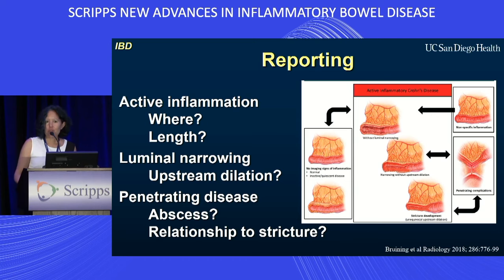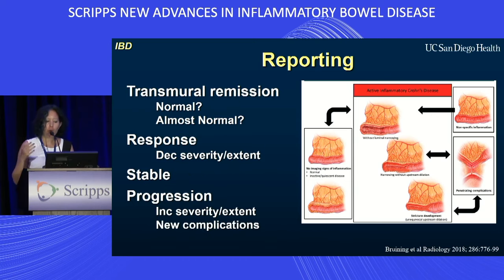But now we're starting to do kind of like radiology 2.0, right? So now we want to tell you even more about this. Now let's talk about responsiveness. And so what changes can we say are happening from one exam to the next? Can we say that there's transmural remission?